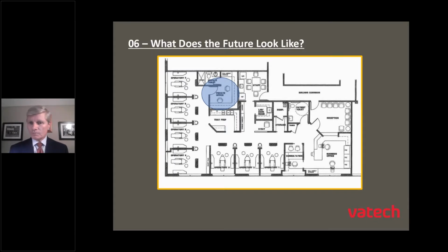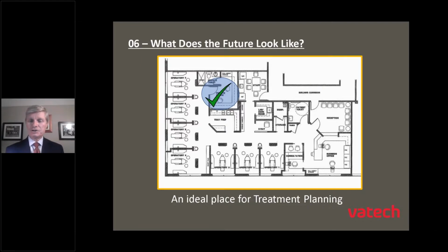For those of you that have just perhaps incorporated CBCT in your office and are maybe feeling less than 100% confident when it comes to navigating the 3D software, I strongly recommend using your private office, even first for a couple minutes, to evaluate, and if you have the opportunity, to treatment plan your case rather than doing it in front of the patient.